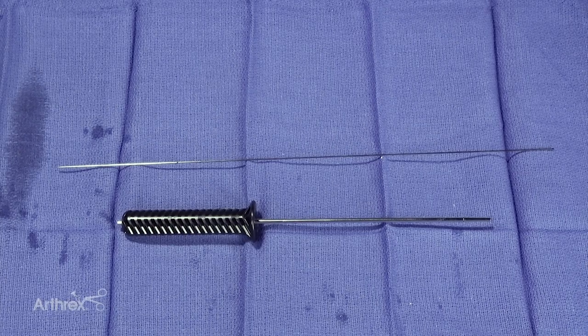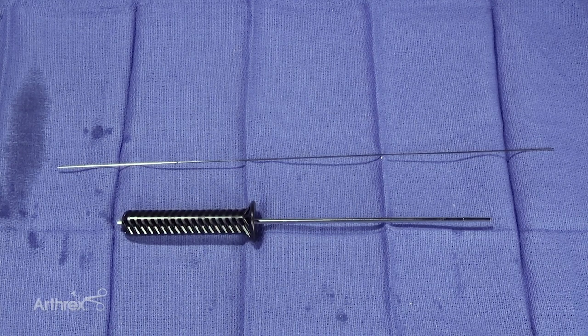Today we're going to look at our disposable kit for inserting an interference screw — for really any graft in which you have a bone plug, most commonly your bone patellar tendon bone graft. This would certainly work for an Achilles bone plug or a quadriceps bone graft as well.